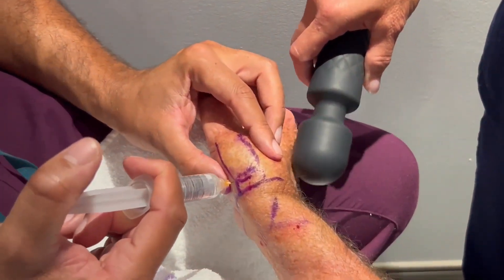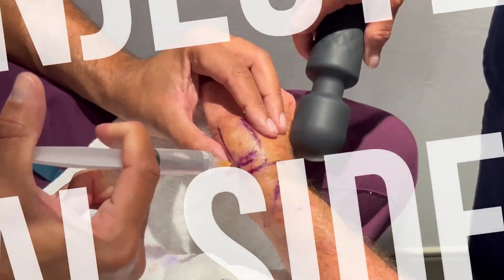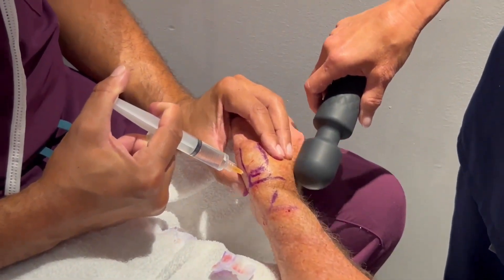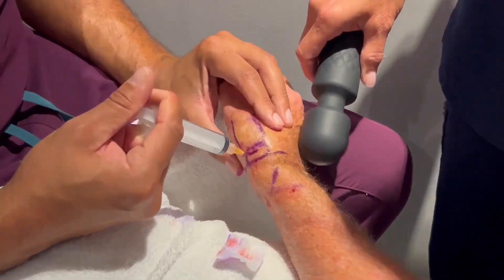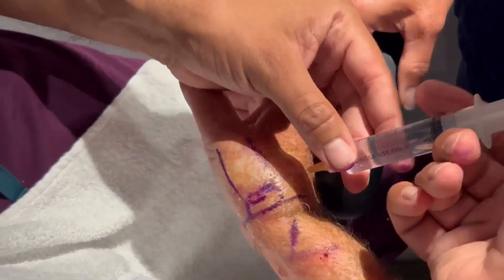Then we're going to do the same thing on the radial side of the joint, aiming towards the base of the metacarpal bone, all the way to the ulnar side of the base of the metacarpal bone, with a 25 or 27-gauge needle.